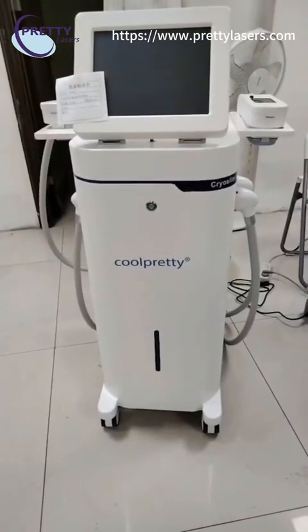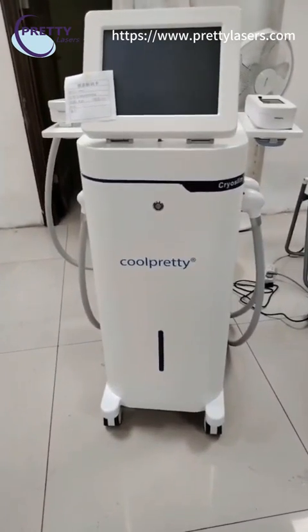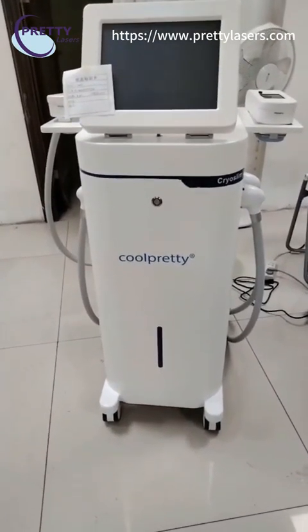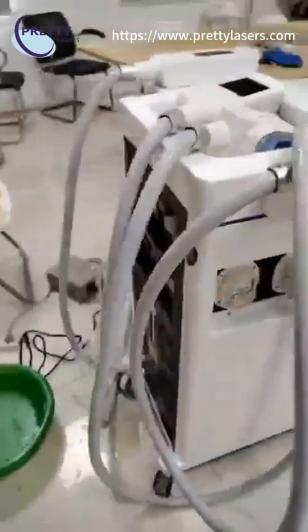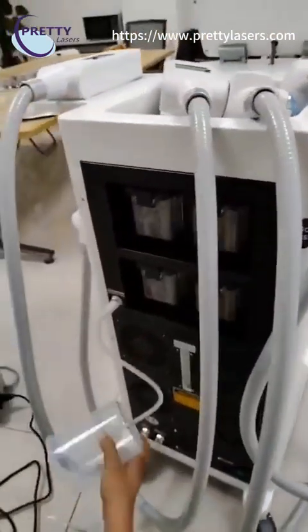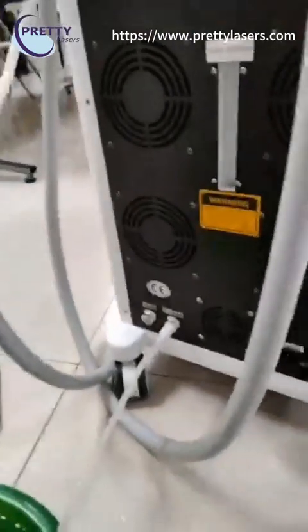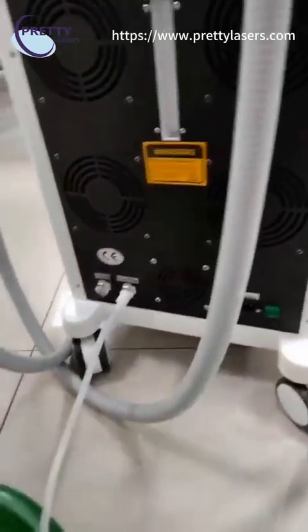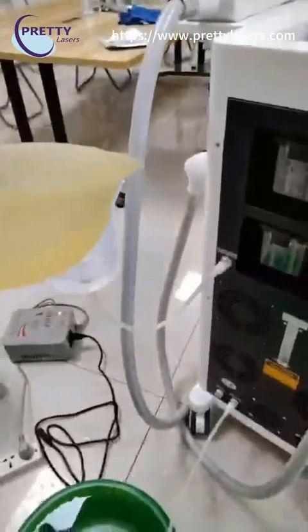Now we are going to show you how to operate and install the 360 flat pressing machine. Before turning on the machine, we must inject water. Insert the tube on the water inlet hole, and insert the tube on the water flow outlet hole, then inject the water.